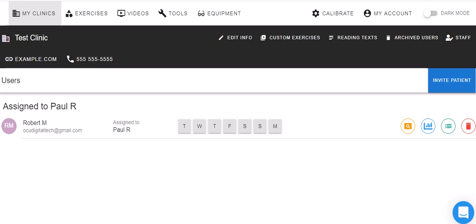It's also some objective data that you can use in your progress reports. You can tailor the remainder of your program based on these findings. And again, the nice thing about the progress check is this is a generic sequence. You can adjust the activities that you want to do with the individual based on some of the interactive exercises that are available. So this is how we've been doing a progress check, and I hope that it's helpful.